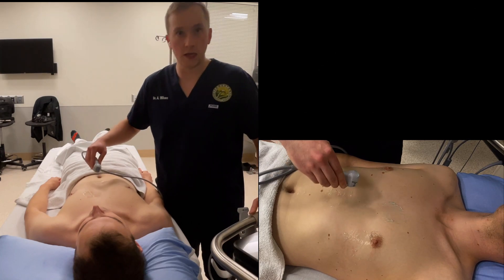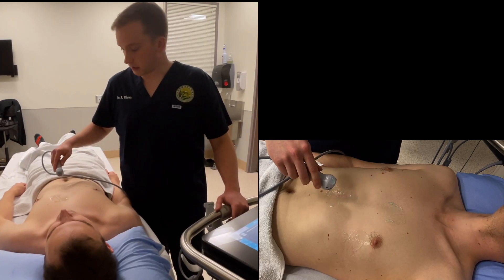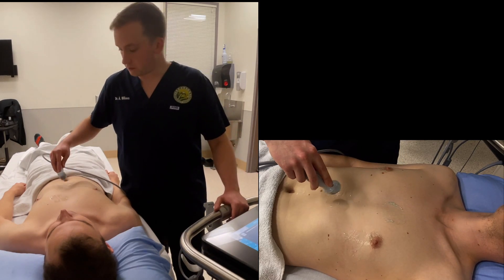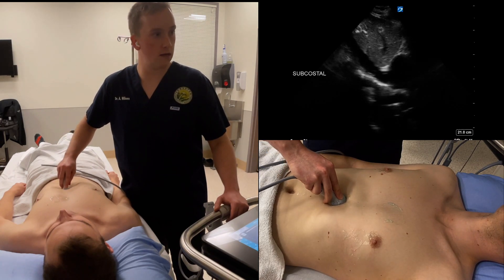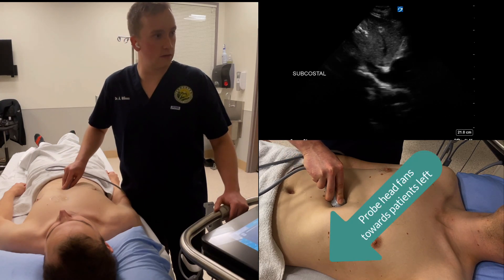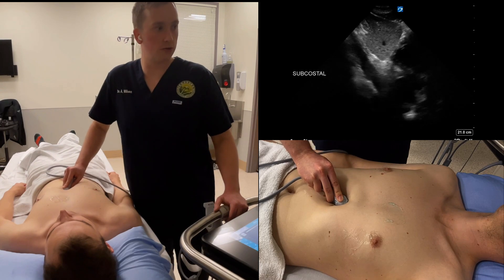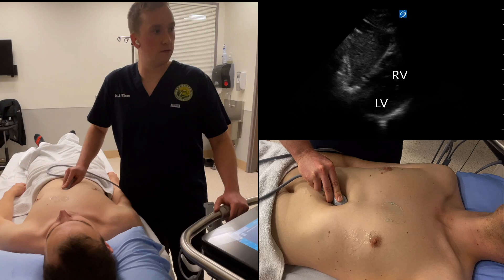The last view we'll obtain is the subcostal short axis. This is a particularly useful view when you can't attain any parasternal views, and it appears similar to the parasternal short axis. You find this view similar to how you would find the IVC — placing the probe immediately subxiphoid with the marker towards the patient's head — however, you're going to fan to the patient's left, towards the heart. It should appear similar to the parasternal short axis view, with the right ventricle in the near field and the left ventricle in the far field.